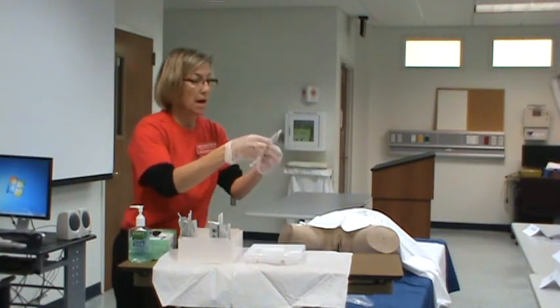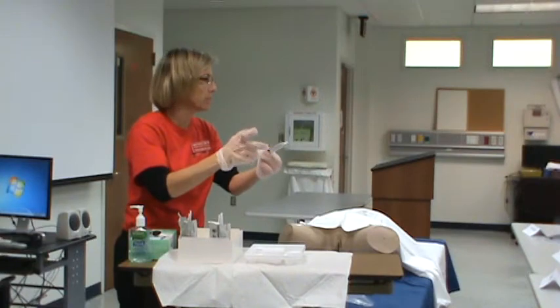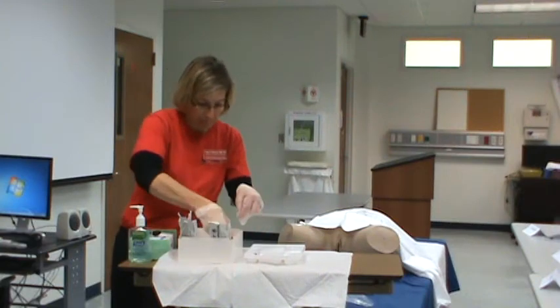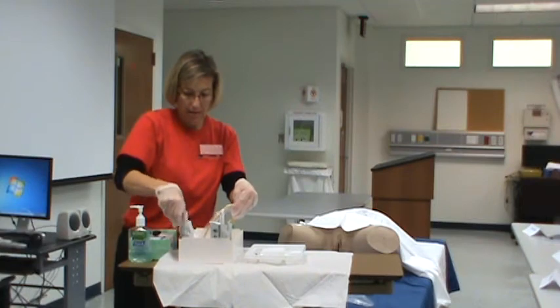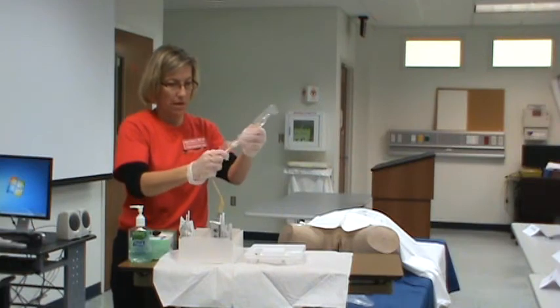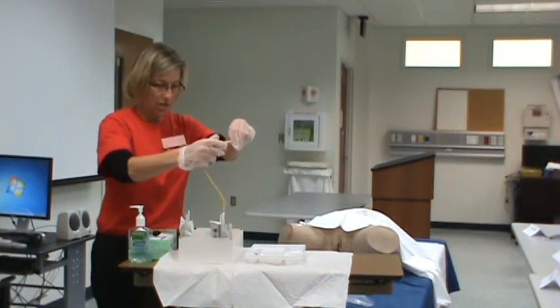This is the syringe that, again, a difference from the video was they had a syringe of lube. Okay, fine. You figure out your kits. Again, they're all different. So this is my syringe. Bags are on these. I just kind of squirt out the bag. I'm sterile, so I can do these things. And I don't really care where this one falls. I'll pick it up if it doesn't hit the trash can.